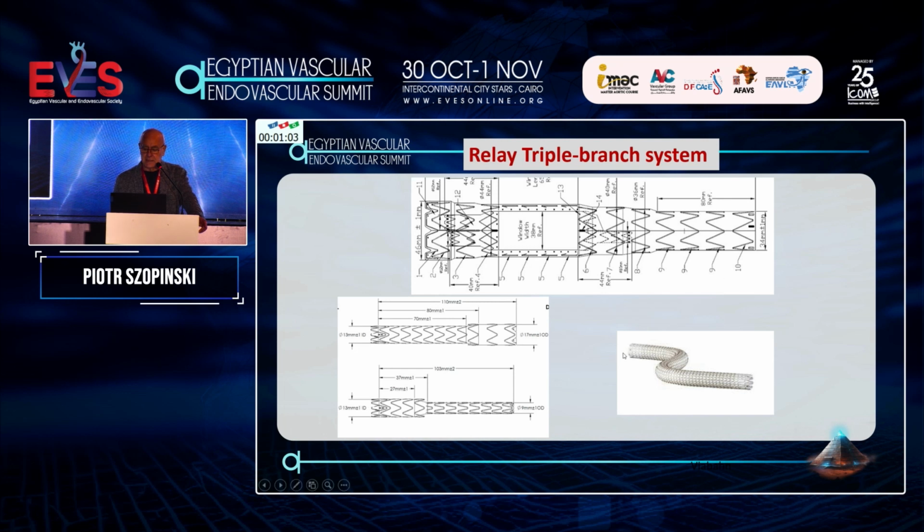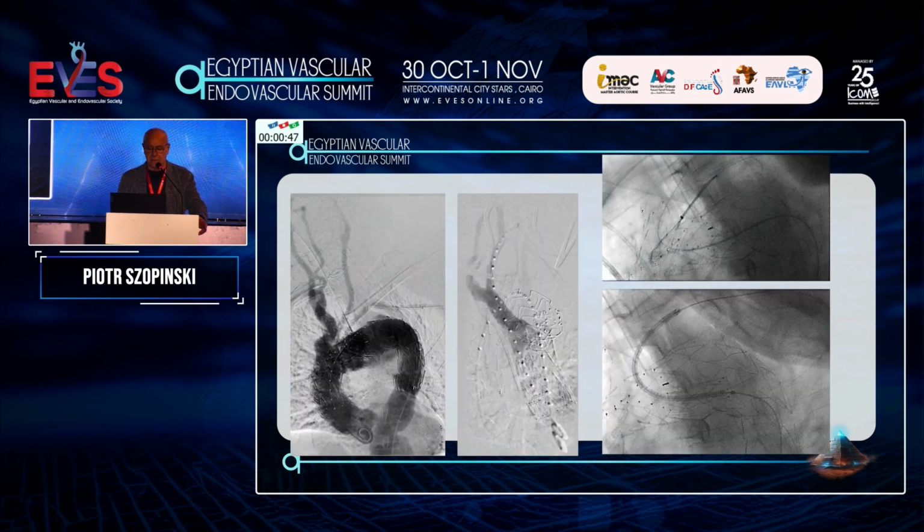And this is a situation where we normally use a Viabahn self-expandable stent graft or VBX, when the angulation between the LSA and the aortic arch is quite good. And here you can see the operation, how it looks, playing with the wires in a different way. It's possible from the femoral access as well as from the brachial access, and that's what the previous speaker told.